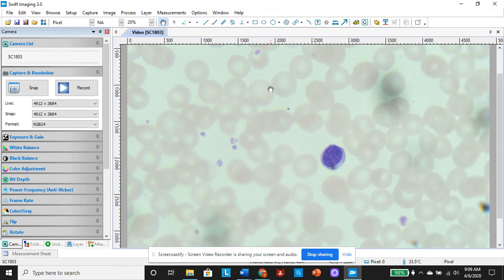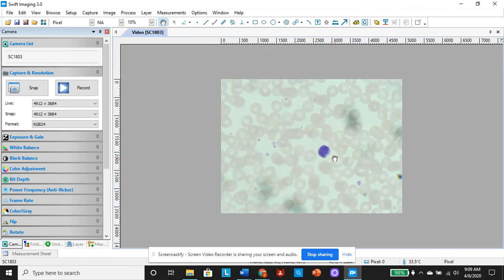So that makes your red blood cells turn a really nice kind of, if you were looking at it in the microscope, pinkish color. It's like a salmony pink color. The lymphocytes turn this nice kind of robin's egg blue, they call it, around the outside. And then all the nuclei have this nice globular purpley color.